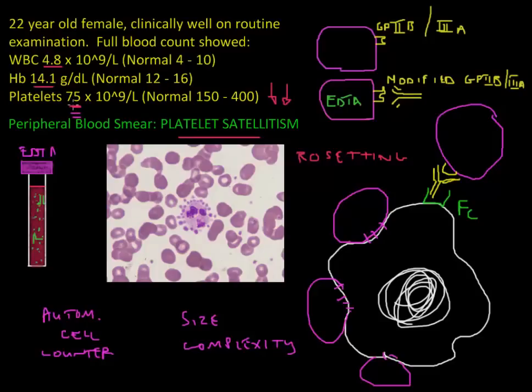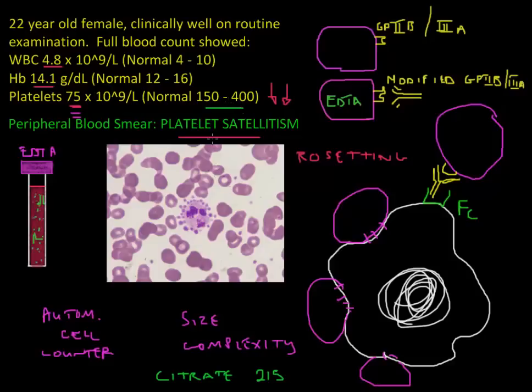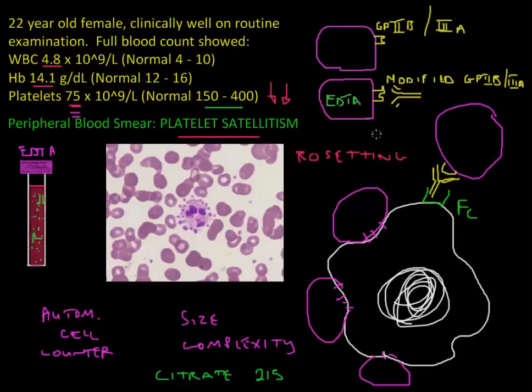The real platelet count is higher than reported. In contrast to platelet clumping, which can happen with different anticoagulants, platelet satellitism only happens with EDTA. If you repeat the blood count with citrate, another anticoagulant, the true platelet count was found to be 215, which is completely normal — the normal range is 150 to 400. When the blood smear was repeated, the patient had no platelet satellitism any longer. This is another example of pseudothrombocytopenia — a falsely decreased platelet count.